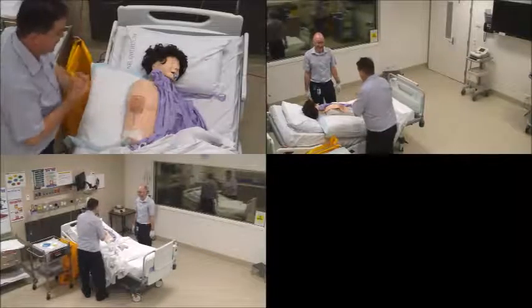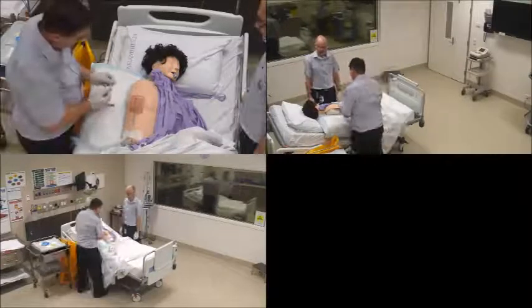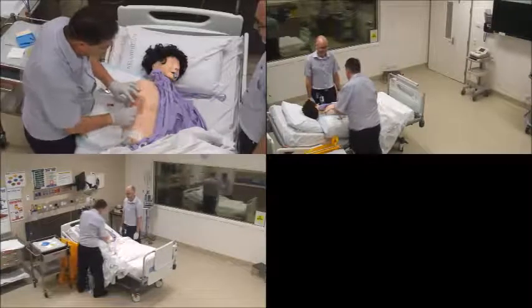Scott, are you comfortable there? Yeah. Okay, are you happy if we continue? Yes. Just a bit cold, I've just got some remove wipe to go at the top.